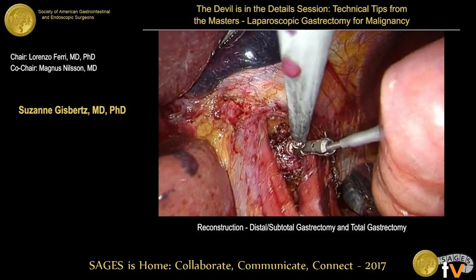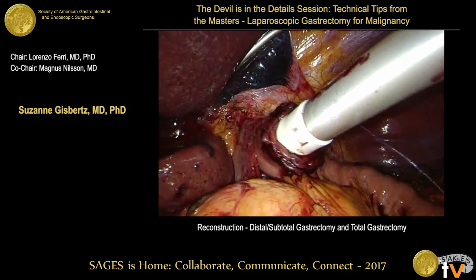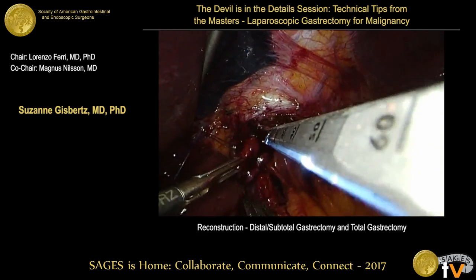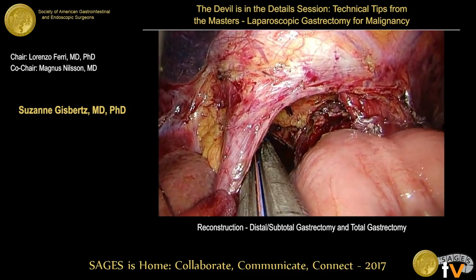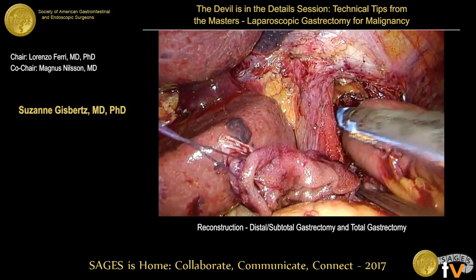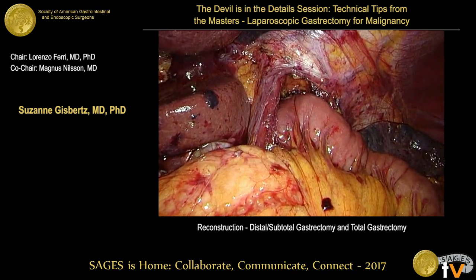The small bowel is prepared and the circular stapler is inserted. The stapler parts are aligned, closed, and fired. With a linear stapler, the small bowel is then closed. There should be enough space between the small bowel closure and the circular stapler line to prevent ischemia. It's very important to have a tension-free anastomosis without rotation.